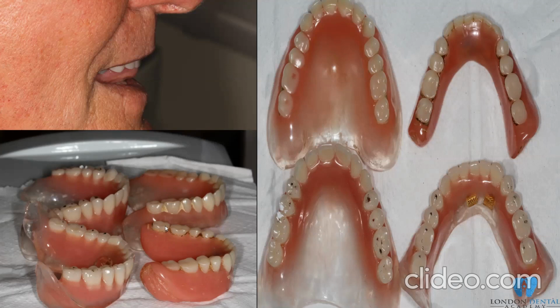The patient will struggle, will come back to you over and over and over asking for better dentures. These dentures are not amendable. When I look at these dentures, straight away I would say, sorry to say that, these are not fit for purpose. These are not meant for you. We need to have something better fitted, as you can see, the curve of Spee, the occlusion, and the occlusal contacts all in place, the anterior teeth, and the curvature of the teeth and the tuberosities, along with the inframolar height and the buccal shelves, all coming into action in order to give us nicely designed and nicely finished dentures. So we need to be careful when we design.